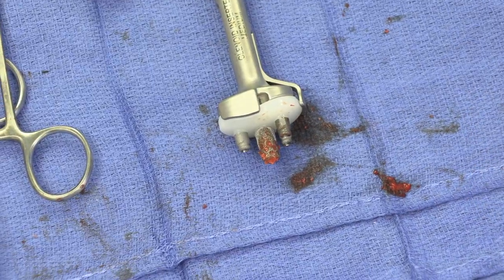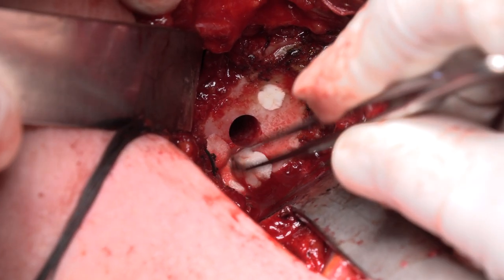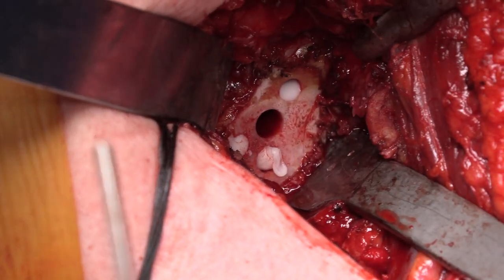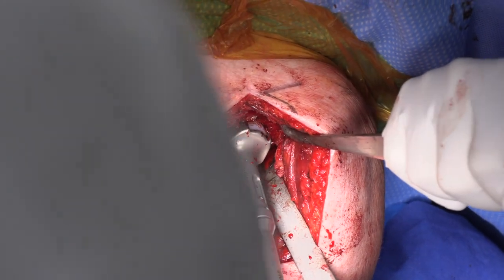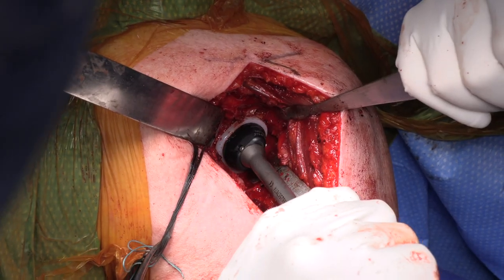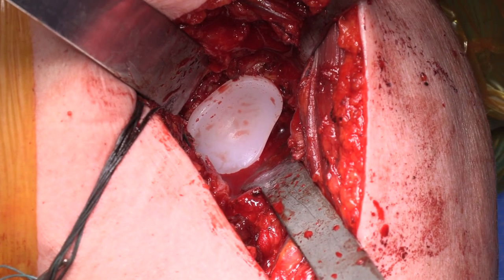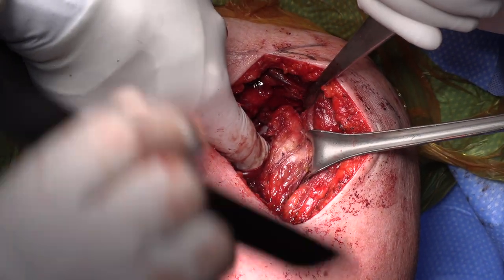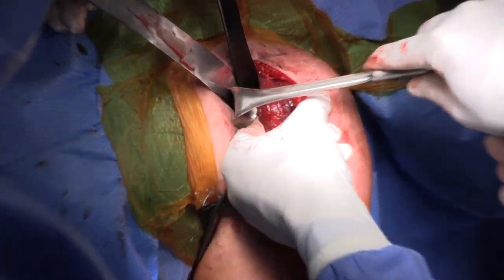The prepared glenoid is irrigated copiously and packed with thrombin-soaked gel foam. The packing is removed and the cement is injected into the prepared peripheral holes. The caged glenoid component is inserted and impacted into place, and should be fully seated with use of sequential impactors. Any excess cement is removed. Since the central bone cage provides an excellent initial interference press fit, waiting for cement hardening is not necessary, and final preparation of the humeral component can proceed.